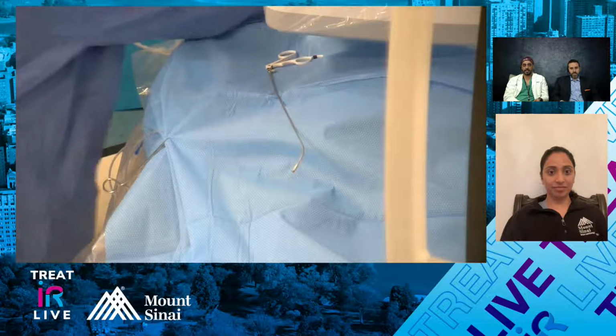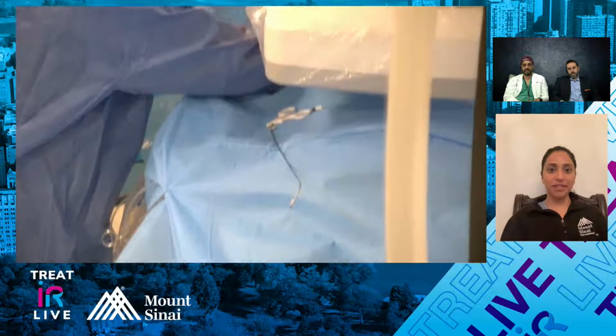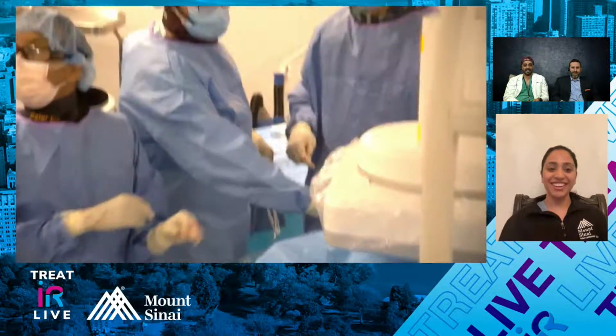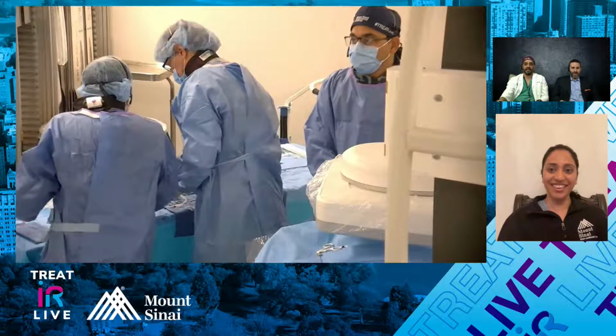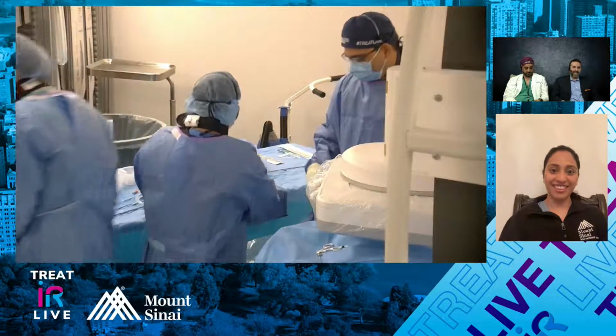Mona, are you able to get these forceps, or are they still on back order for you guys as well? Same. We keep ours very safe. Yeah, it's a very hot commodity nowadays. Somebody should put AirTags on all of these in case they get thrown out at the end of a case and we have to go get them. So if you have these at your institution, do not let them go, because they're very difficult to get now.